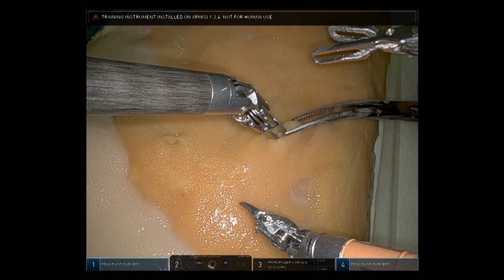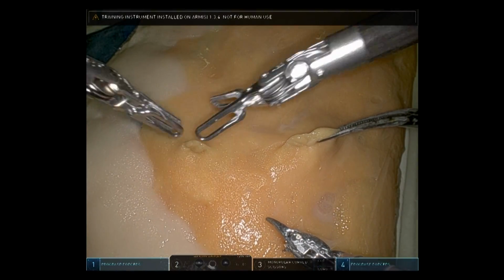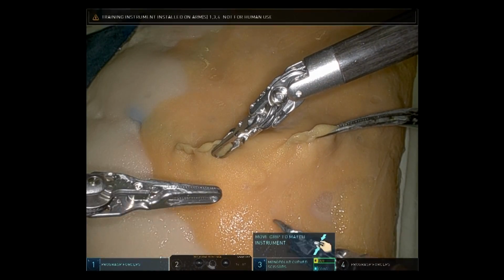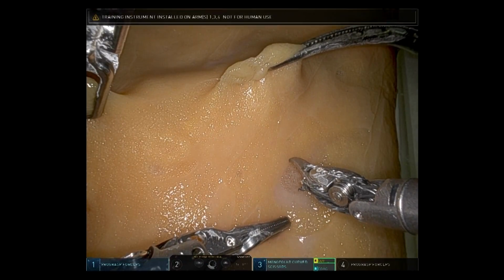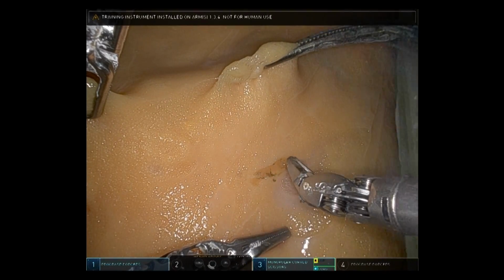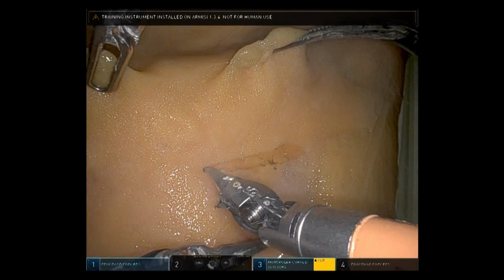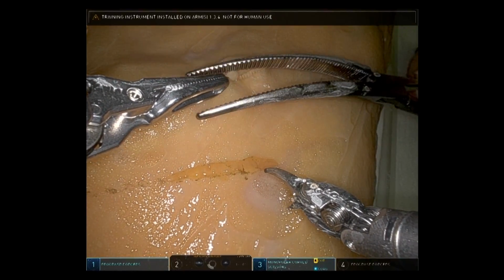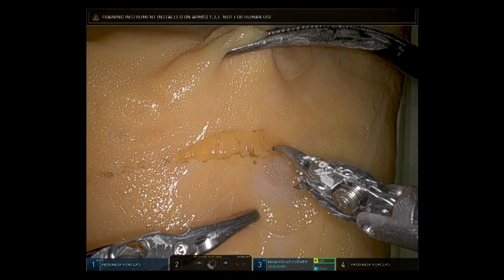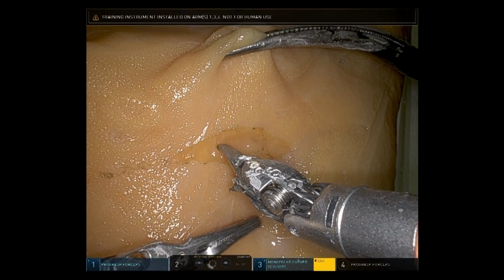The pedicle of the ileocolic artery, ICA, is grasped and elevated using the assistance forceps and the fourth robotic arm. The peritoneum on the caudal side of the vascular pedicle is incised, and dissection of the mesentery is initiated. The assistance forceps and the fourth arm should be adjusted as necessary to optimize the surgical field.